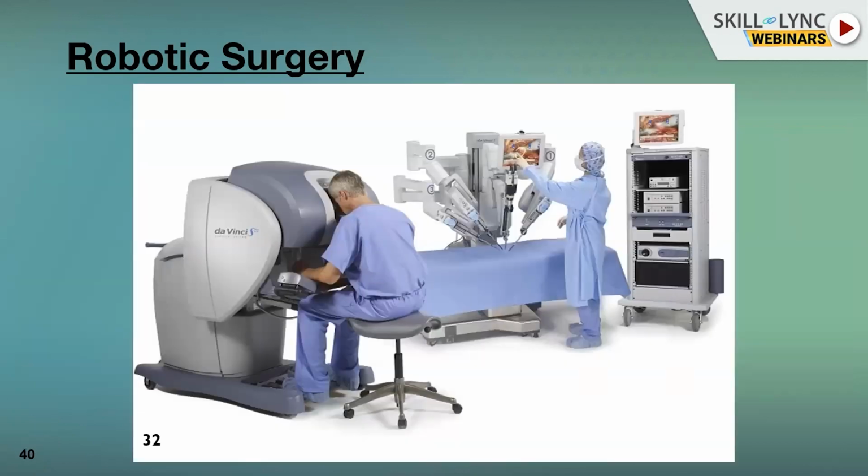So here you can see one such system which is there in the market called DaVinci. DaVinci is a company which manufactures robotic surgery equipment. Here you can see the nurse is placing all the robotic arms in such a way that the doctor is sitting somewhere farther away, so he can control the instruments by using the console. The doctor doesn't even have to stand near the patient and do the surgery these days. Okay, so this is the advancement in the medical industry using the endoscopes and laparoscopes.